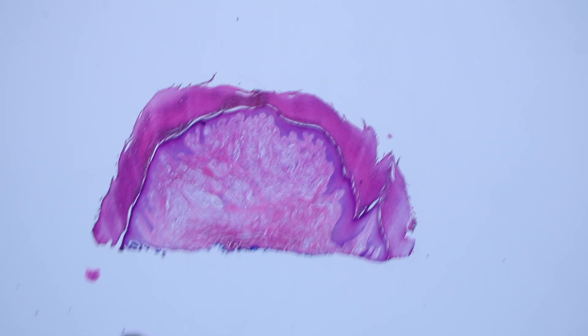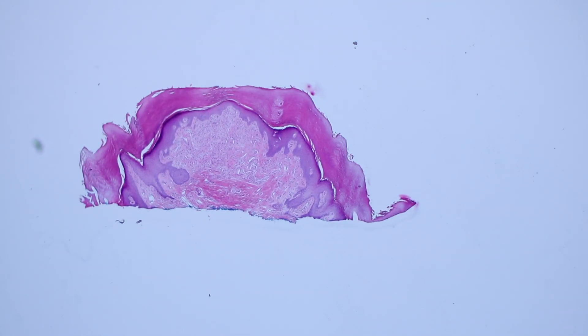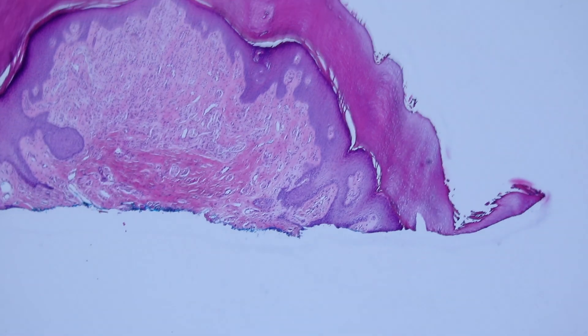This is a shave biopsy of a papule, a little bump, on acral skin. You can tell it's acral skin because it's got a thick epidermis and a really thick layer of orthokeratin for the corneal layer.